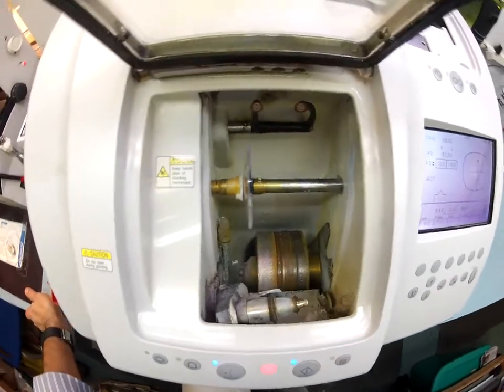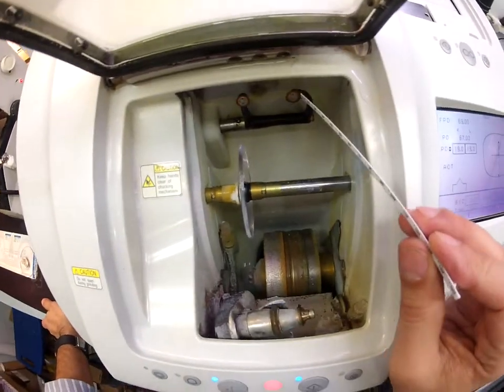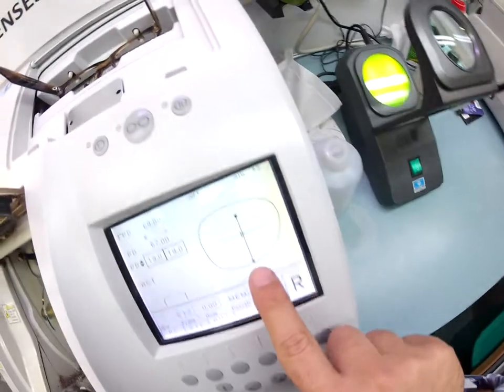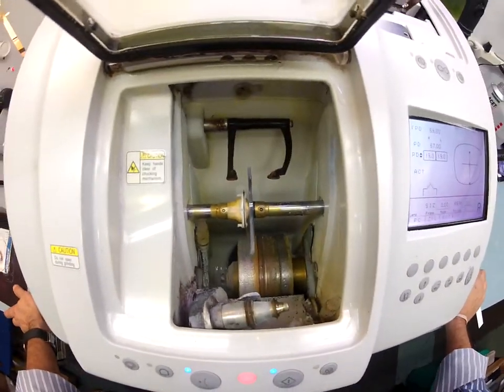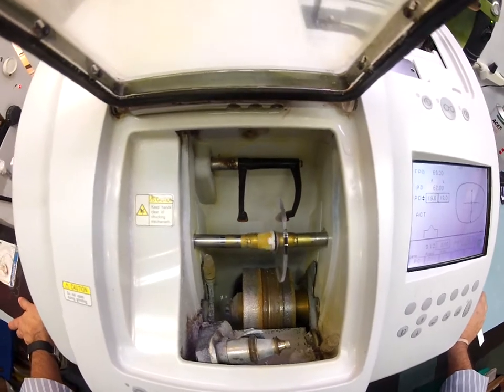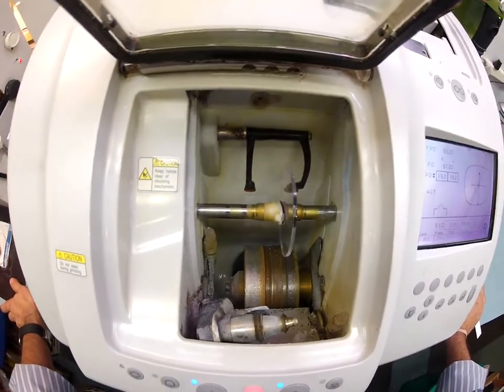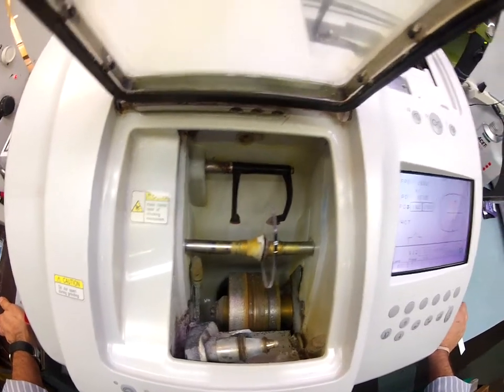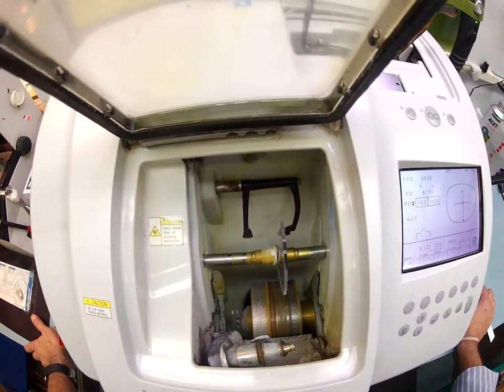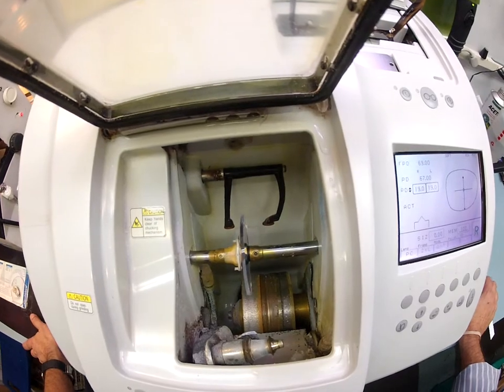The first thing that's going to happen is these calipers are going to come down and trace the shape of your frame, that shape. It's going to trace the shape on the back side of the lens, which is the concave side of the lens closest to your eyelashes. Then it's going to scoot over and trace the convex side of the lens, which sits away from the face. The calipers all the while measuring the thickness of the lens to know exactly where to put the bevel.